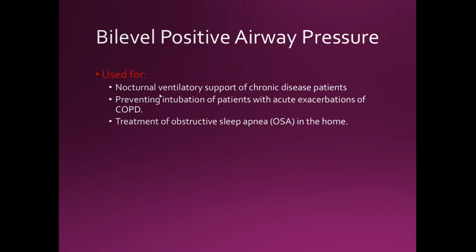Your respiratory rate that you put in the BiPAP is going to kick in due to this total cycle time. So the machine is going to say, hey, look, Bob is supposed to breathe every 6 seconds. Bob didn't breathe. I better breathe for him. That's the beauty of our backup rates, because if the patients can't breathe, we can breathe for them. So in central sleep apnea, use BiPAP.